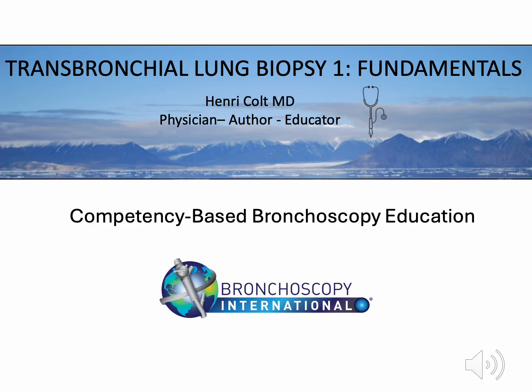Transbronchial lung biopsy, commonly abbreviated as TBLB, remains one of the most valuable bronchoscopic techniques for obtaining samples of lung parenchyma without resorting to surgical biopsy. Like every invasive procedure, however, success depends on far more than technical skill alone. Appropriate patient selection, careful preparation, sound clinical judgment, and meticulous technique are equally important. Throughout this presentation, we will emphasize not only how the procedure is performed, but also when it should be performed and how complications can be minimized.